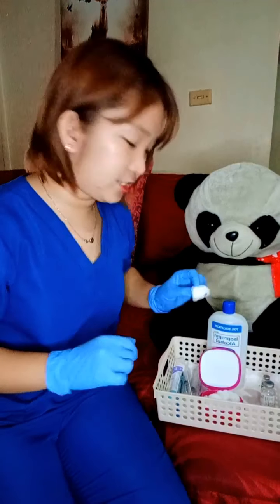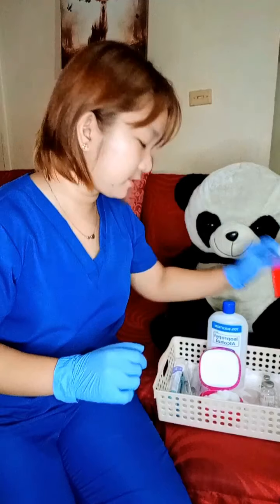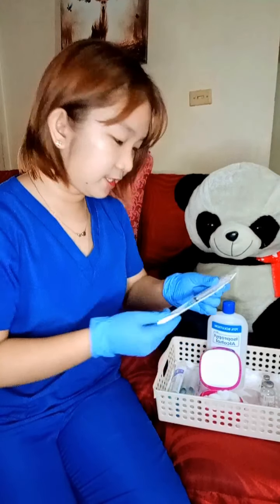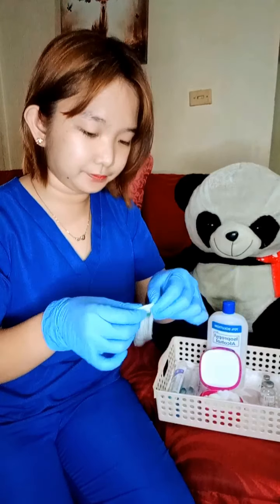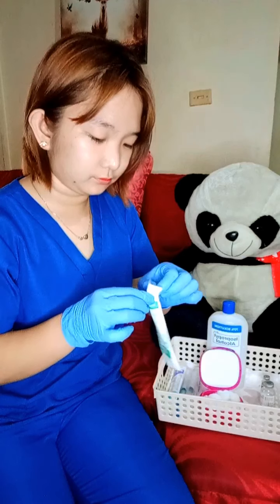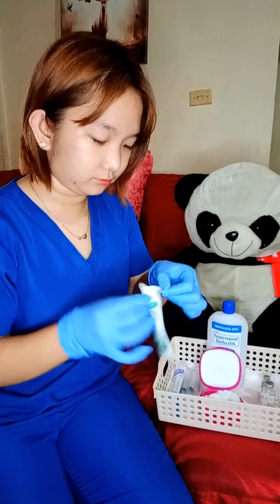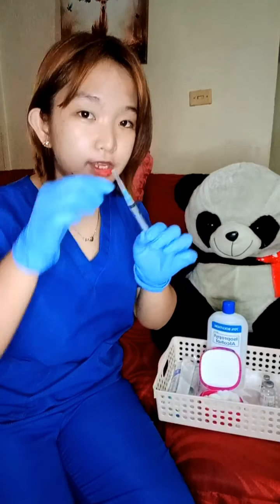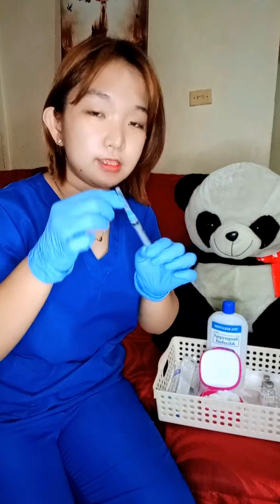After that, get the syringe. You can now dispose of this. Get a syringe that you can use. Once you get the syringe, you can now pull the needle cap.